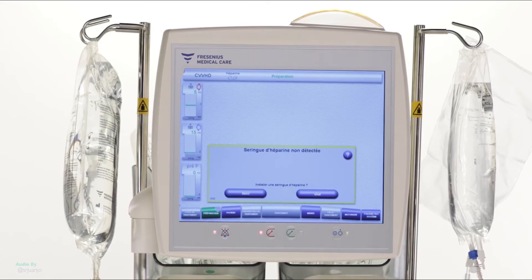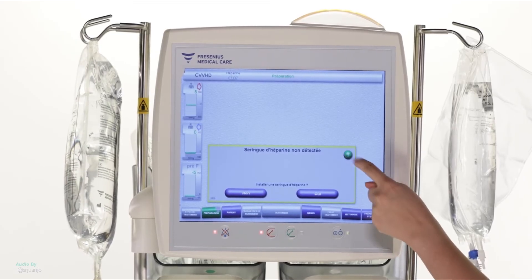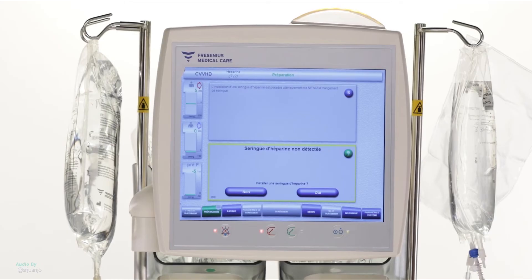This type of message will appear with a sound alarm. For each alarm or warning, touch the button with an interrogation mark for help. The system will tell you how to solve the problem. The installation of the heparin pump is not necessary during a therapy with citrate anticoagulation. Press NO to skip this step.